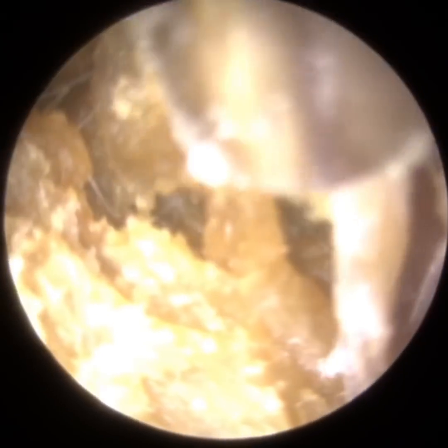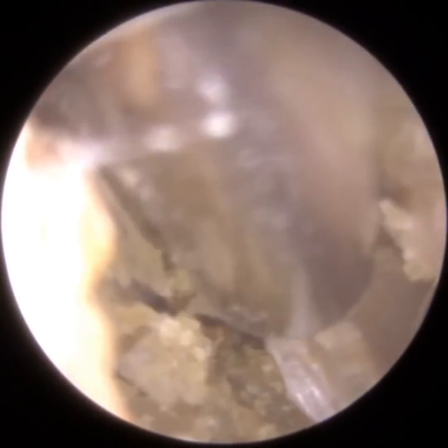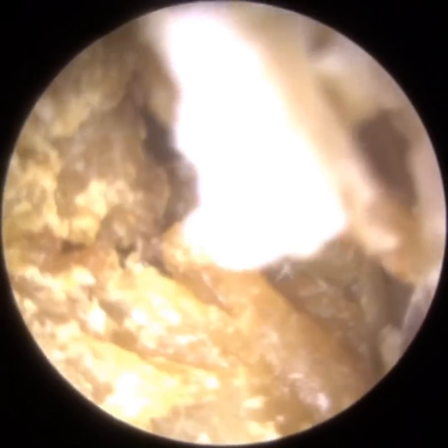Now, they actually attended for primarily treatment in the left ear. They did recognise that their right ear was blocked. By the way, this is the second time I've seen the patient. They came about a month ago, and you can imagine just how frequently they need their ears cleaned, because this was totally cleaned just a month ago. They primarily attended to have their left ear cleared.